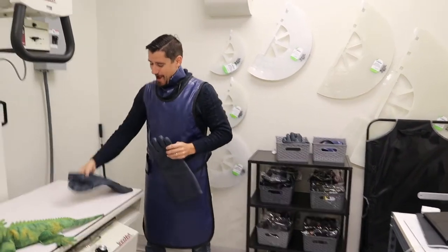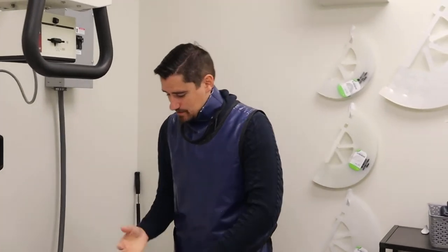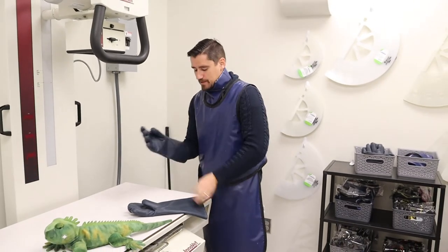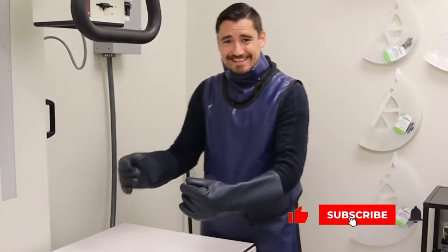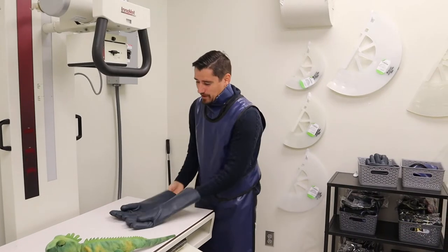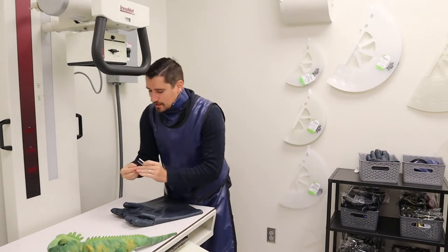You know what's tough? I grab a right glove all the time and then I grab another right glove. But today we did awesome — got both sides. I'm going to pop this on. Now it's really hard holding a husky with these gloves, but so we have our left and our right.